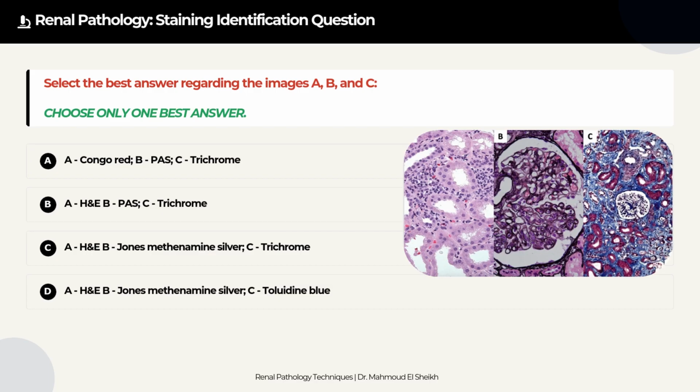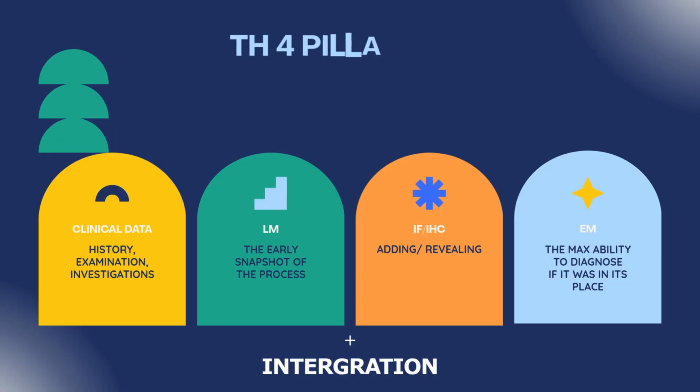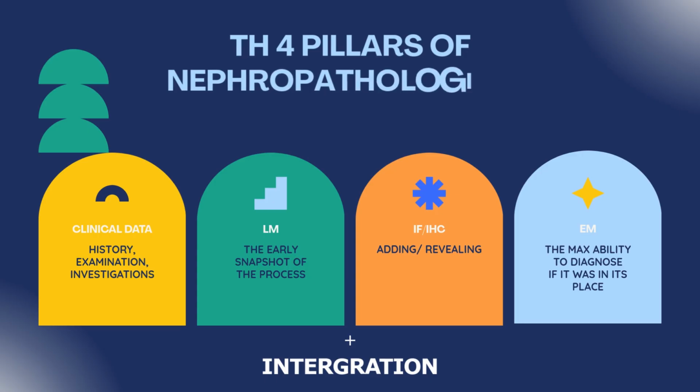Which one is correct? As we progress with our knowledge, we realize that this is not sufficient and we need to have more things, including molecular diagnostics, genetics, and also other techniques. But so far, we are mostly dealing with these techniques, and we will try to go over the basics of these techniques. They're essential for our work.